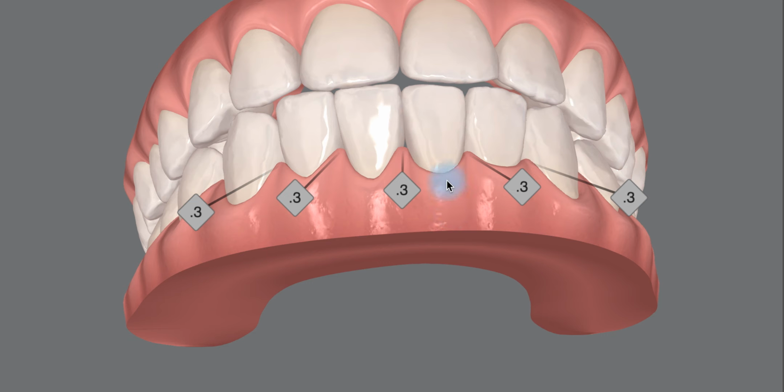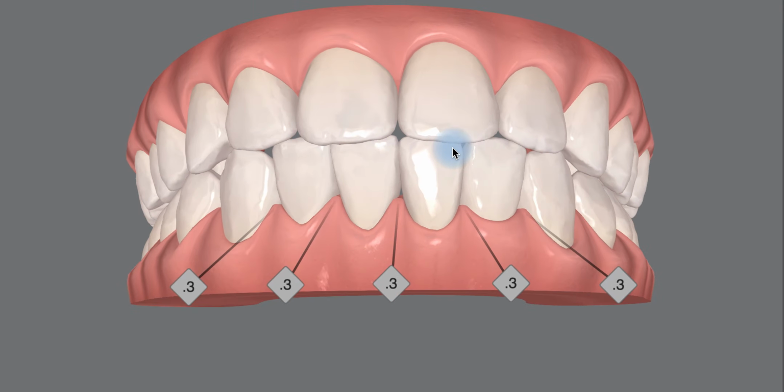I would educate the patient that it's going to take maybe some additional IPR, some enamelplasty of the linguals of the uppers to get things to line up well. This is like trying to force a square through a circular hole to some degree. The patient should know that. This is not as predictable of a treatment modality as fixing a class 1 patient that has some rotated teeth.